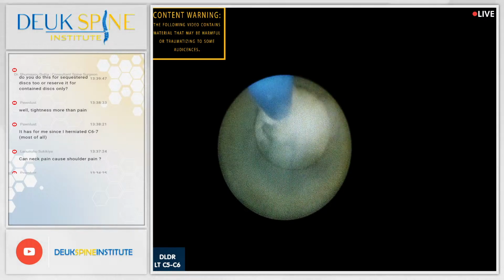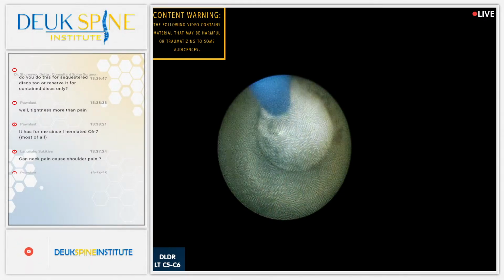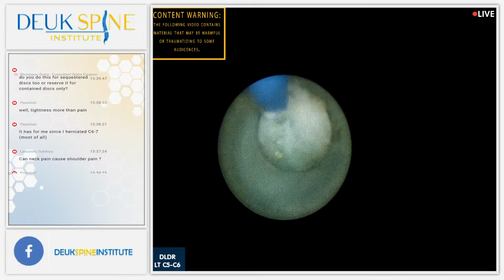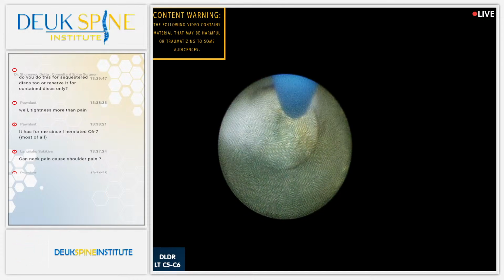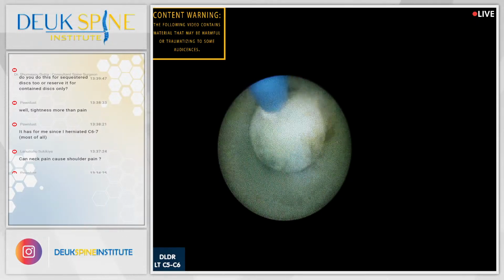All right. Great questions so far. I've got a little bit of herniation stuck to the side of the laser. You guys see that? That little white stuff? And it's kind of blocking my view. It's somewhat annoying me. I'm going to have to take this thing out just to get that off so I could see better. So, oh, it looks like it's still there.